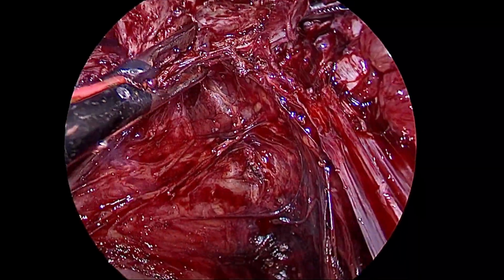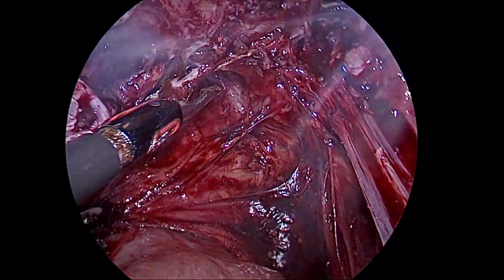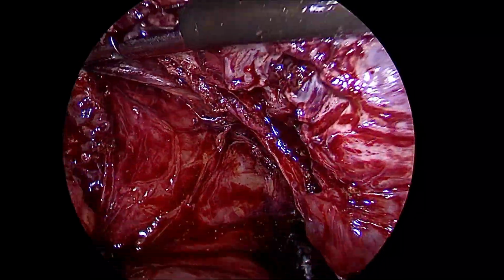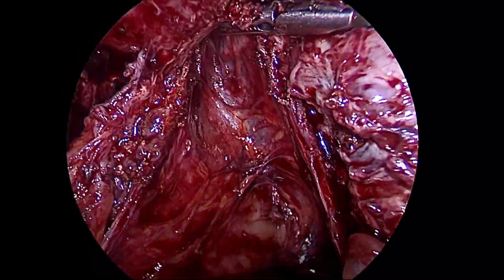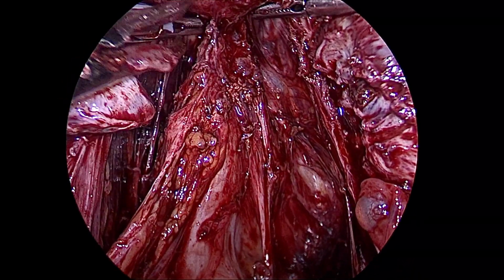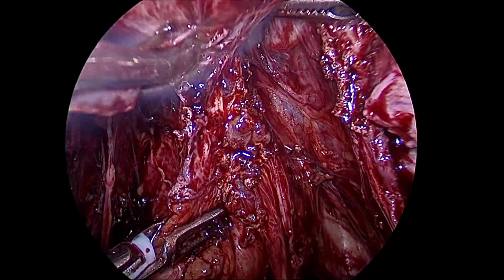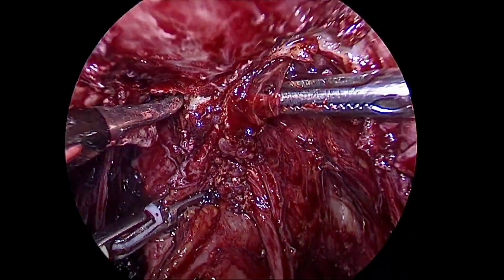Care needs to be taken to ensure that the field of vision is clean of blood and smoke. So from time to time the assisting sister has to see that once the gas is there in the field of vision, she needs to open the exhaust of the 5 mm telescope port, with which the gas gets out and the field of vision becomes very clear.